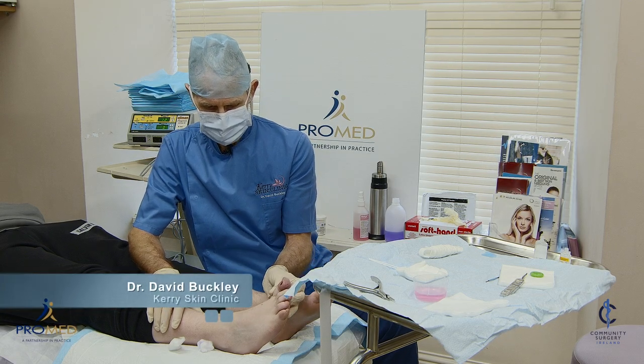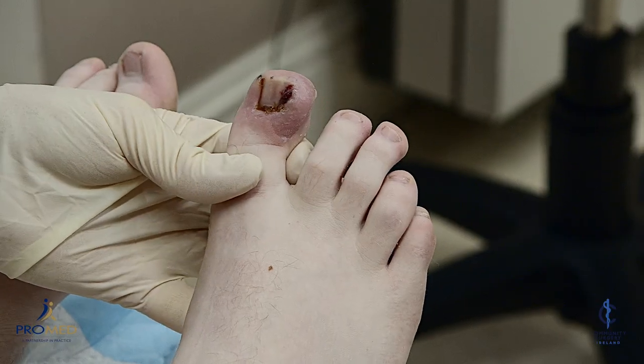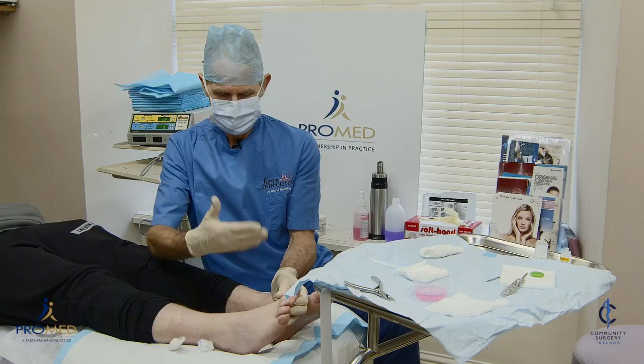Scott is 18 years old and has an ingrown toenail that has been going on for six to nine months. He's had three antibiotics and it's still not clearing, so obviously he needs surgery.